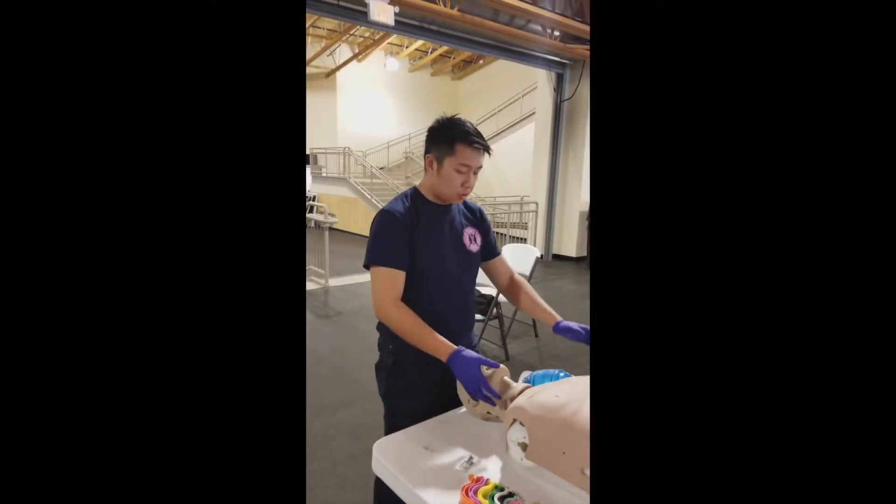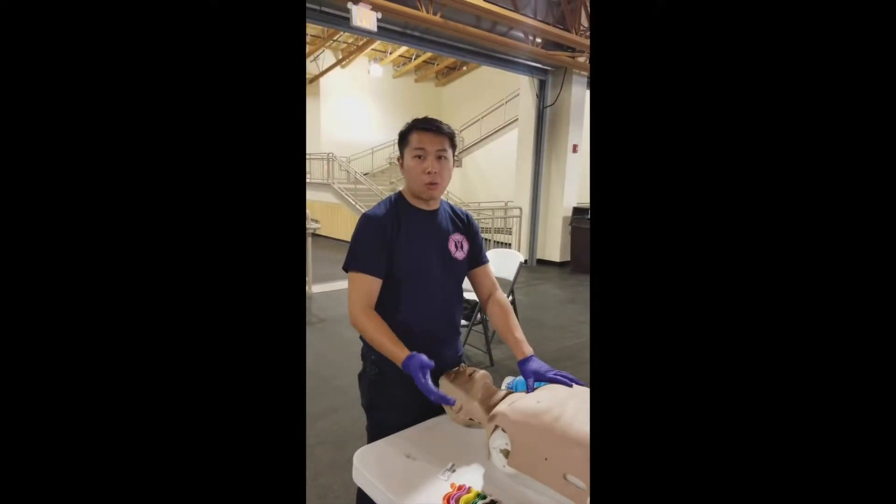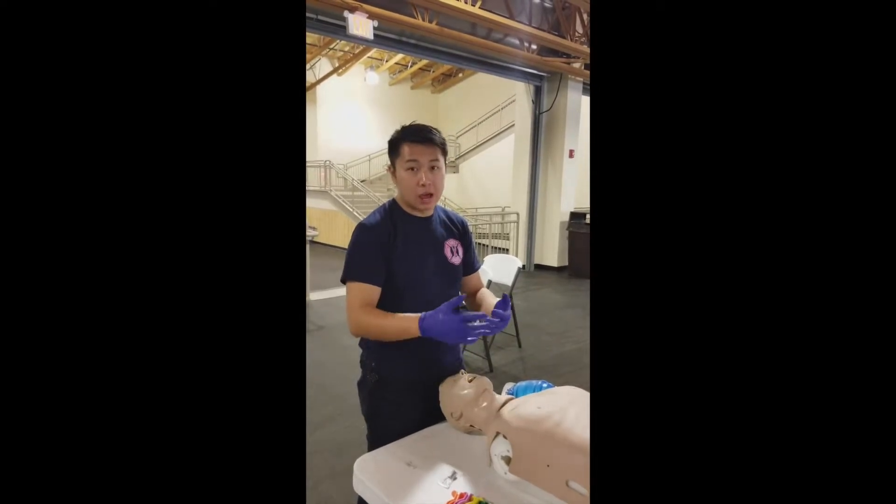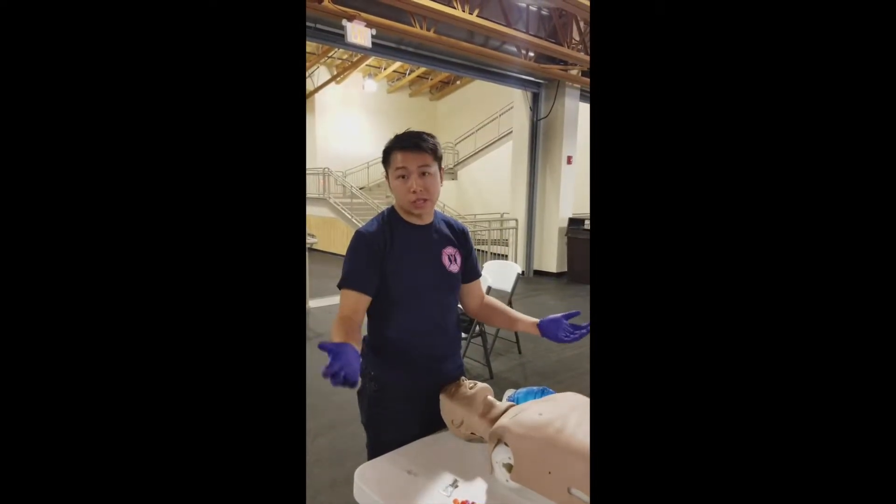I'm Tenry Kwan, I'm with Ski Patrol, and we're going to demonstrate our different tools for airway management. So before any skill station or before any skills, we're going to have our BSI on, our gloves, and we're also going to make sure our scene is safe.